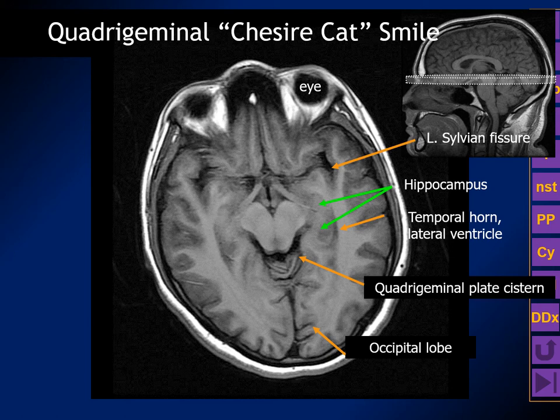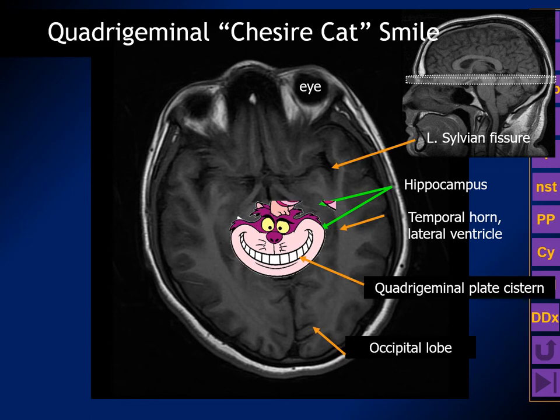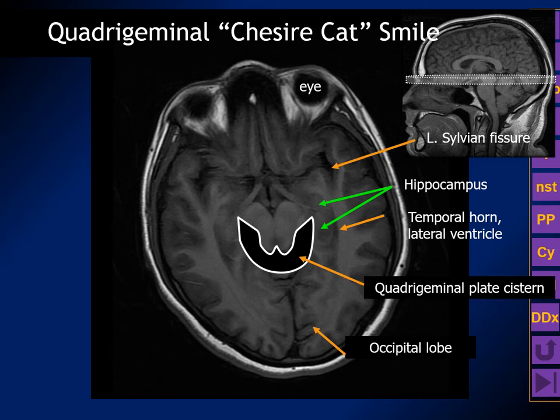In a child, we can tell it's a young patient because the sphenooccipital synchondrosis is not fused — that normally fuses at puberty. We can see the anatomic landmarks: the clivus, the cerebral aqueduct of Sylvius, the fourth ventricle, the corpus callosum, flow voids in the branches of the anterior cerebral artery, the internal cerebral veins, and the great vein of Galen draining into the straight sinus. The tentorial hiatus goes from the anterior clinoid process to the anterior margin of the straight sinus. On axial T1, the quadrigeminal plate cistern is shaped like a smile — we should see this in every patient and it should be symmetric.